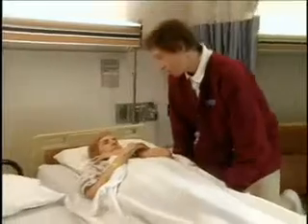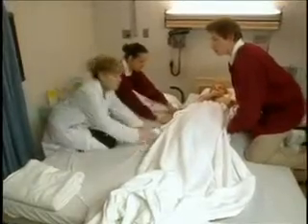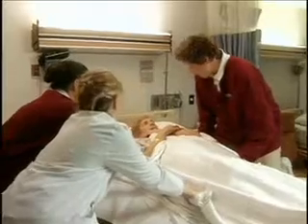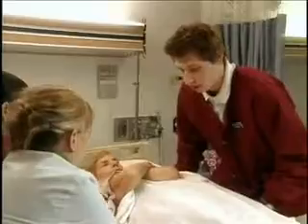Okay, now, Anna, if you can grab the draw sheet at the patient's head and chest area, and Ms. Lewis, if you can grab the draw sheet at the patient's waist and thigh area. Okay. Okay, Mrs. Garrett, we're ready. If you could just fold your arms across your chest for me. Thank you. Okay, now on my signal, you two pull the draw sheet, and I'll lift the patient from the bed onto the stretcher. Okay, 1, 2, 3.